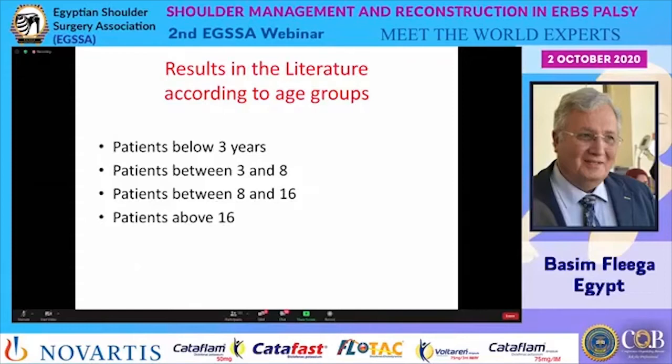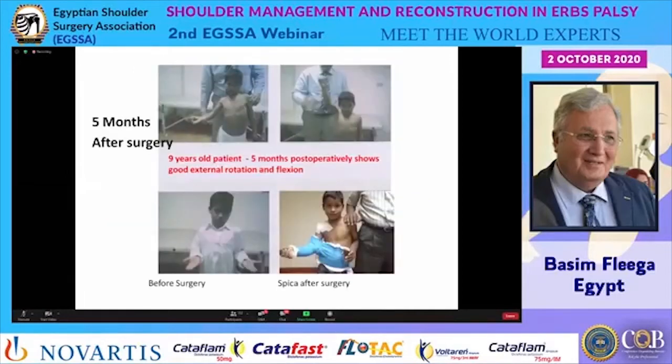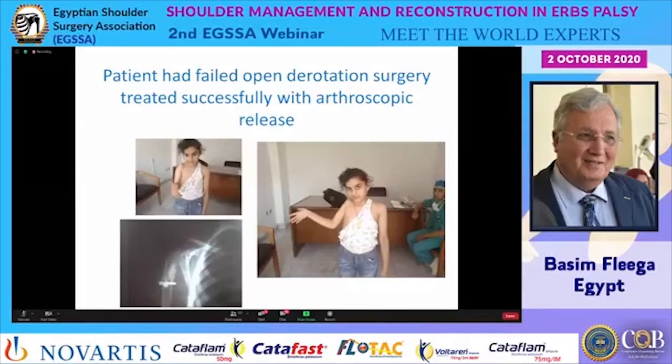The results in the literature according to age groups: we group them into patients below 3 years, patients between 3 and 8 years, patients between 8 and 16 years, and above 16. Also in the literature, the gained external rotation after arthroscopic release will remain in young children and older children. For example, this patient, 5 months after surgery: before surgery, he had no external rotation. A release was done, and the arm was placed in an external rotation spica. And after 5 months, he has more than 60 degrees external rotation and a good elevation. This patient had a failed open derotation surgery. We did an arthroscopic release for her, and this has improved her external rotation.